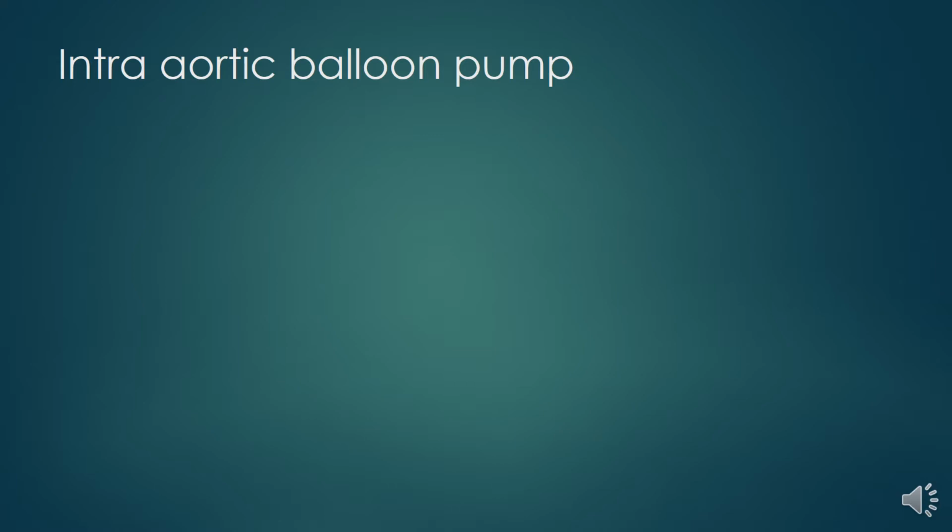The aortic counterpulsation, a review of the hemodynamic effects and indication of the use of the catheter. So the manual adjustment to the timing must be made if aberrant inflation or deflation is present.